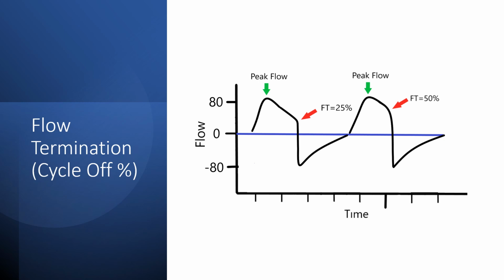So if your patient's breathing 40 or 50 times a minute, this is going to help the machine keep up. And imagine if you use flow term and rise time together, both things in tandem are going to shorten the overall breath cycle. Rise time is going to shorten the inspiratory ascending limb of the waveform, so it's going to reach the pressure more quickly, and then flow term will determine how long it stays at peak pressure.